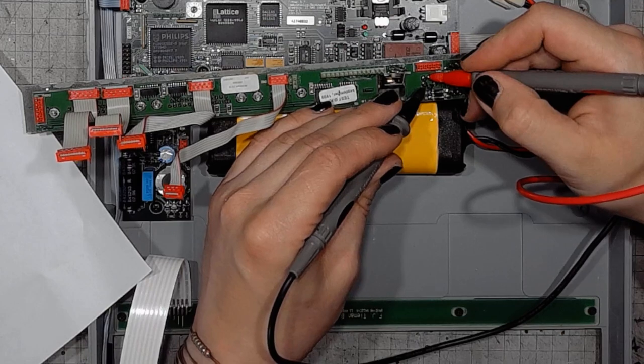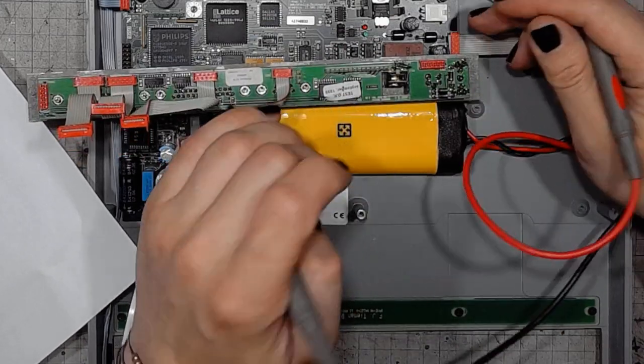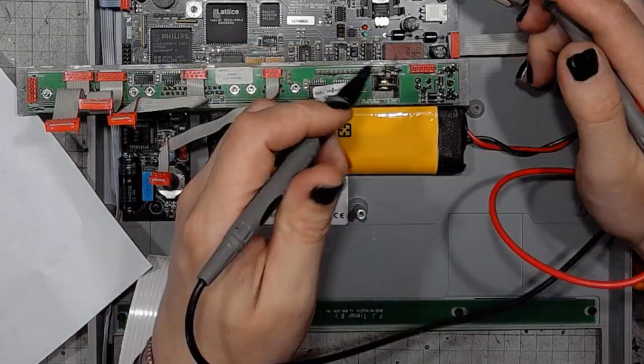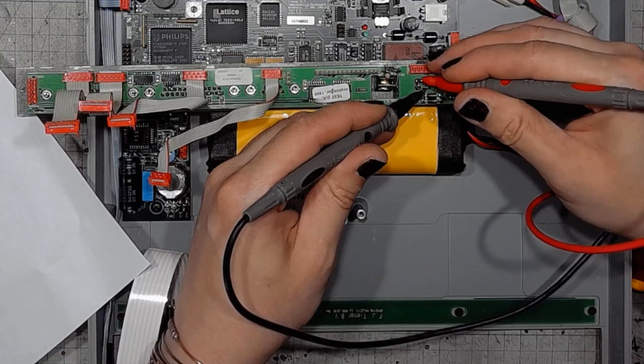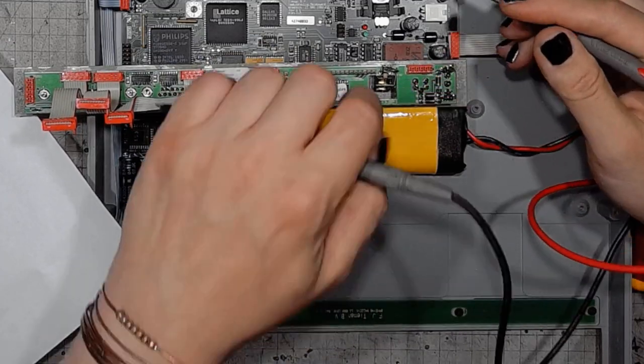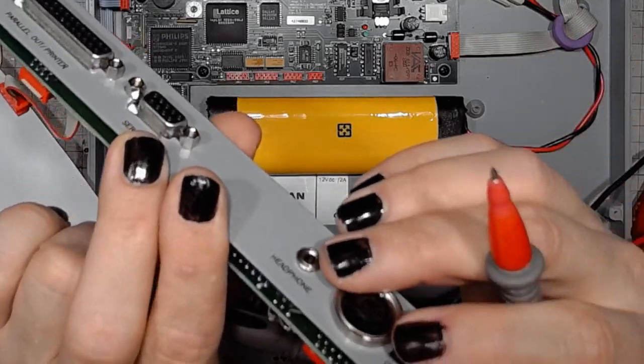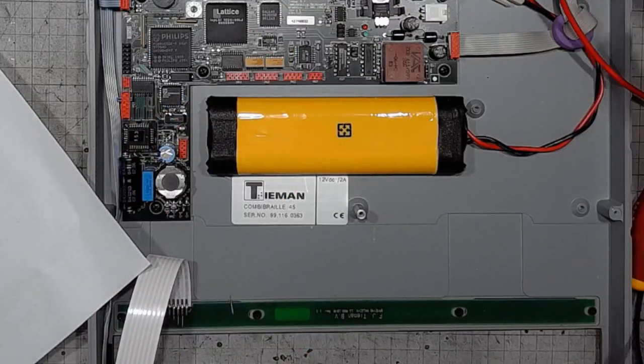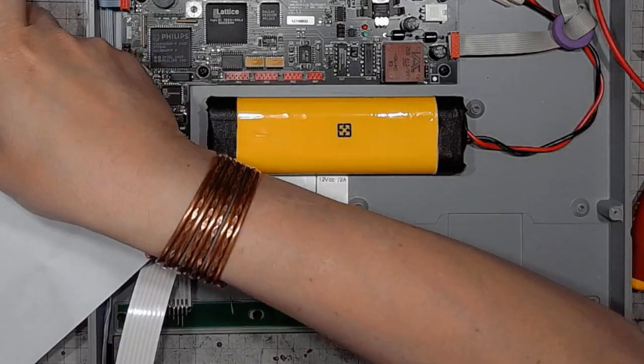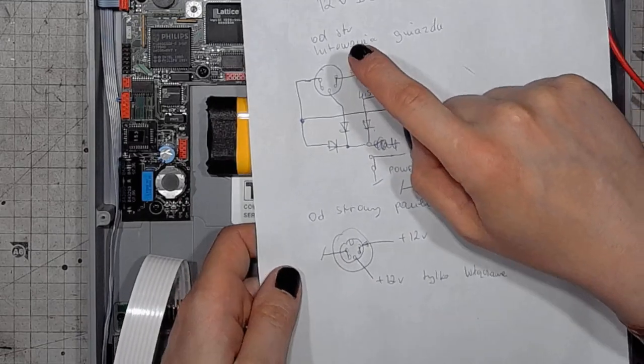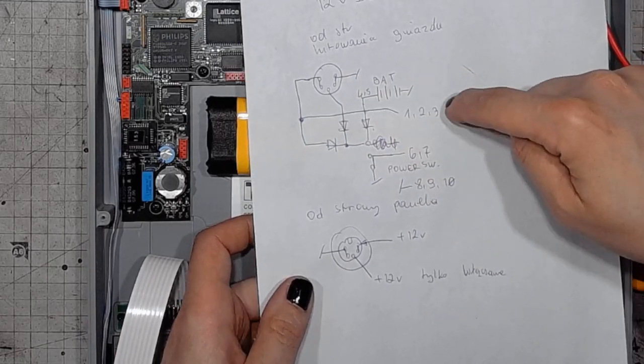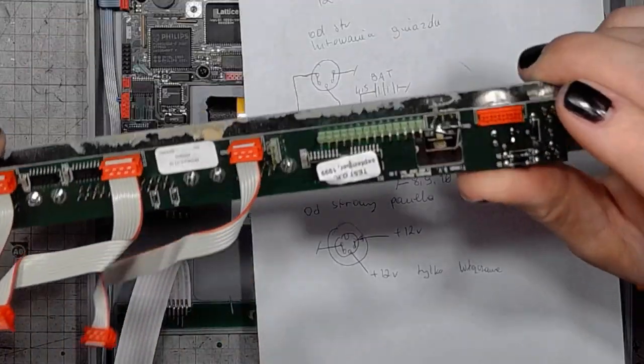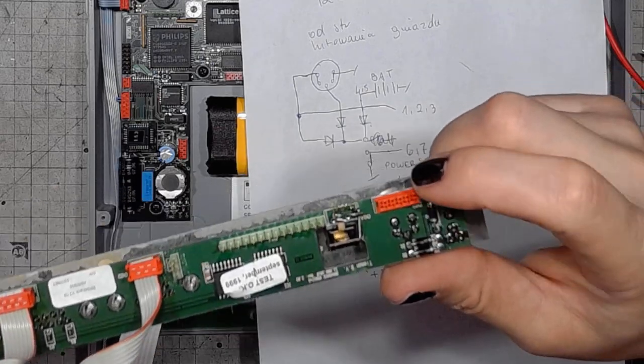And if we use the continuity check, yes indeed, those are connected together. This one is separate. Still separate, still separate. But they pass, they are connected together through diodes, and those two pins.